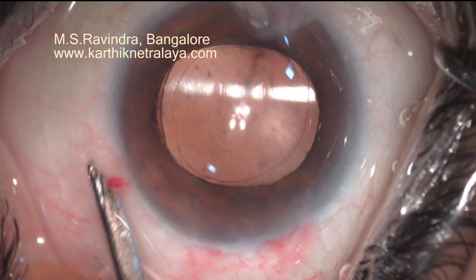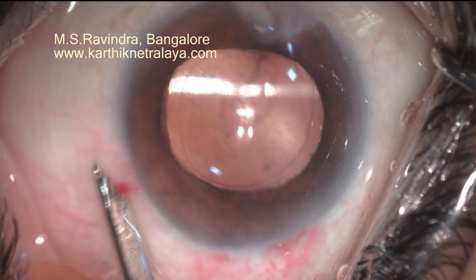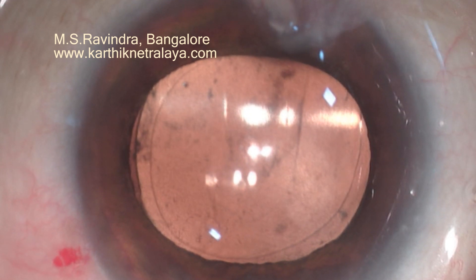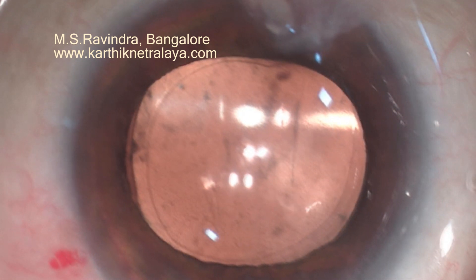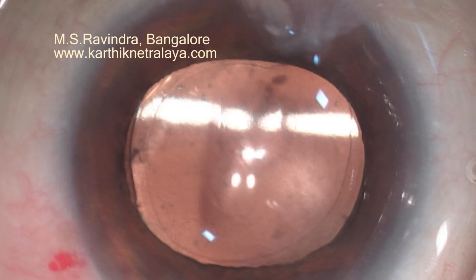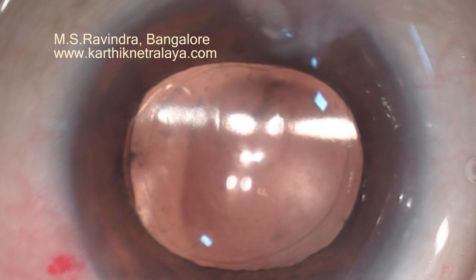The pressure is low — not very high. Let us see it very slowly. Pressure was low at the end of the surgery. I reformed the chamber, which made the anterior chamber deepen a little bit.